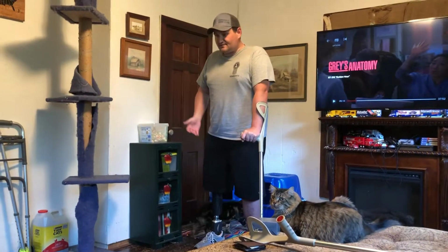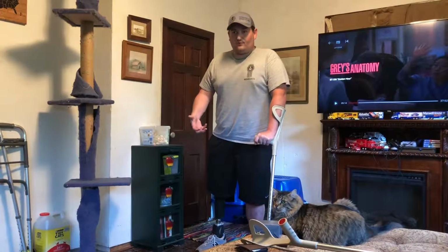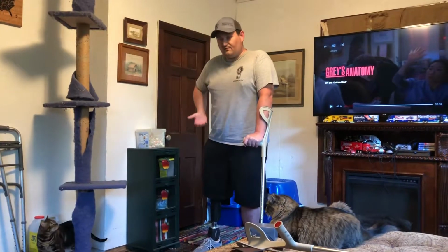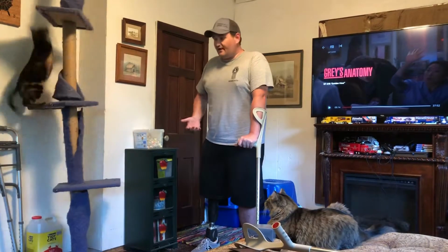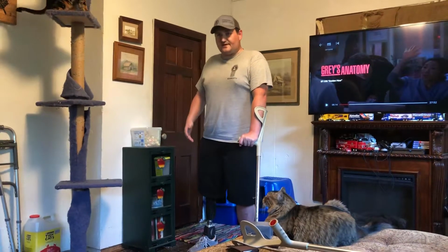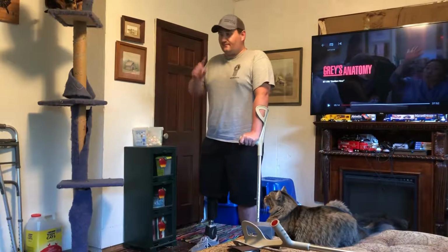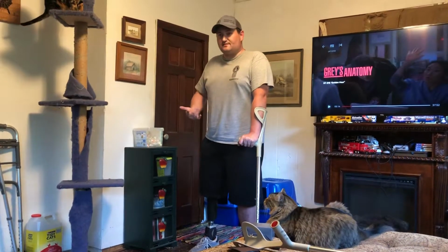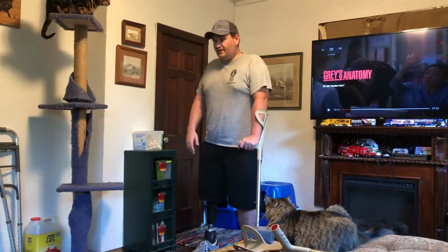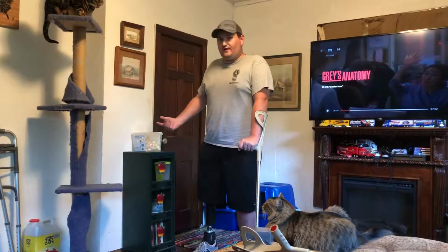The way this foot works, whenever you unload the toe and take weight off of it to break the knee forward, it knows that you're doing that, and it lifts the toe up whenever you're swinging through in your gait, and it just makes it a whole lot smoother, especially once it gets acclimated to you. I think it takes like 500 steps, give or take, to get it adjusted. It auto adjusts, so your prosthetist will probably just do a basic setup on it, just like they would with your knee, and it'll learn your gait and your patterns and all that good stuff.